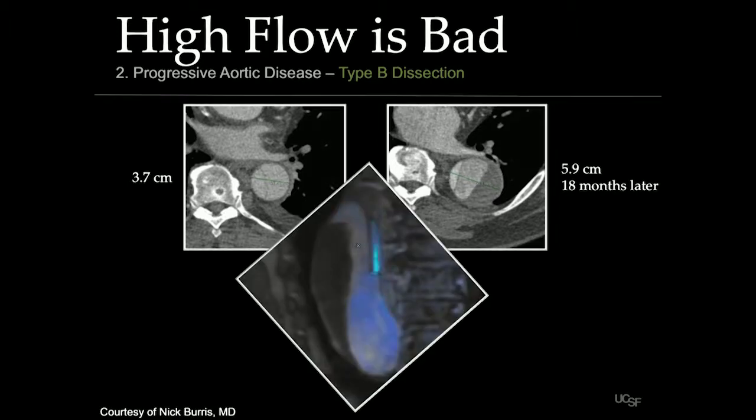So in Nick's case here, if you look carefully, at the inflow region, you can see indeed there's a sizable jet into the false lumen, and then about the same size jet reverse out during diastole. He calculated the regurgitant fraction here, which is very sizable at 90%. So it's really compelling to think that this type of focused analysis could identify this type of case for early intervention.